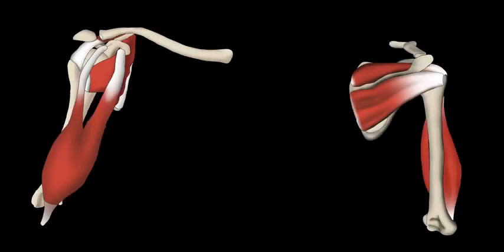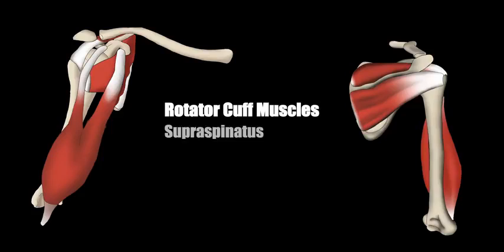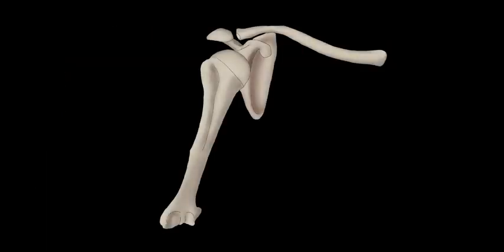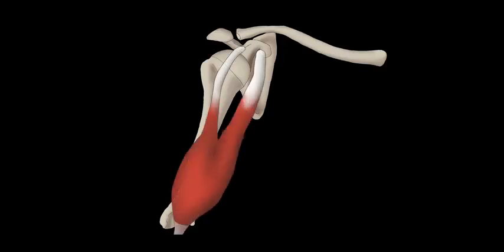The rotator cuff is a group of 4 muscles that are responsible for shoulder stability. Understanding the anatomy and function of these muscles is crucial to performing the ultrasound. The muscles of the rotator cuff are the supraspinatus, infraspinatus, subscapularis and teres minor. For the purposes of a shoulder ultrasound, the teres minor is not always assessed and it does not contribute significantly to pathology. In addition to the rotator cuff, we also need to know about the biceps brachii muscle.